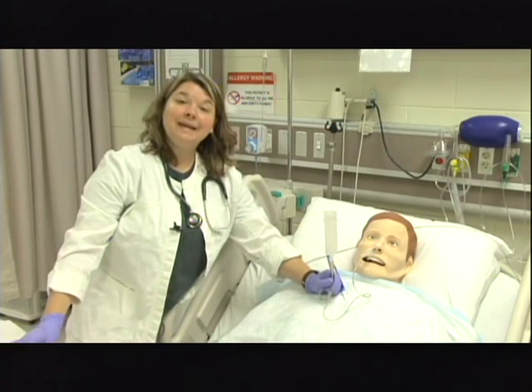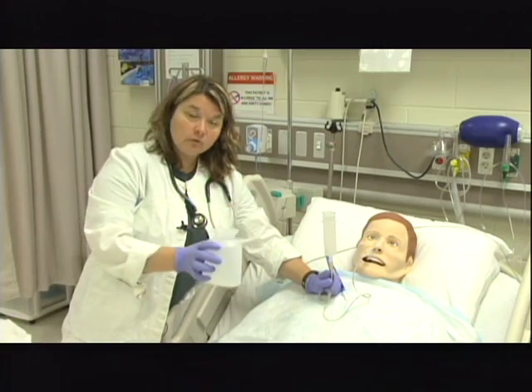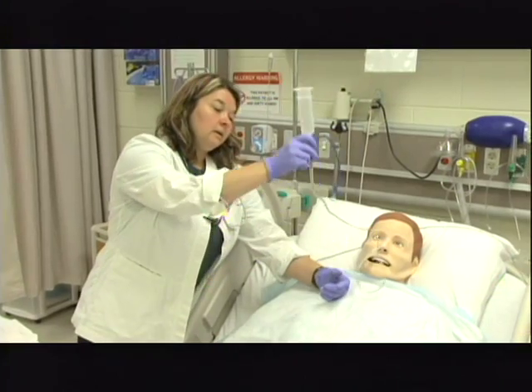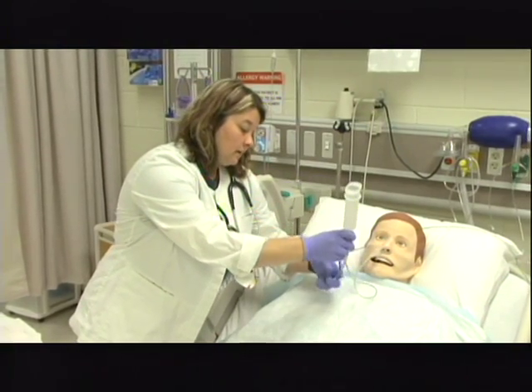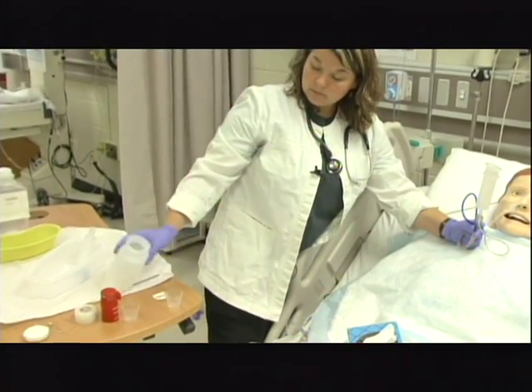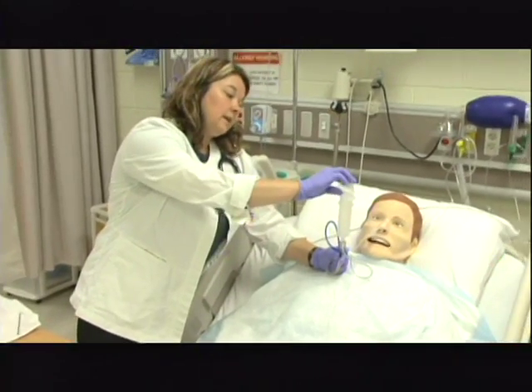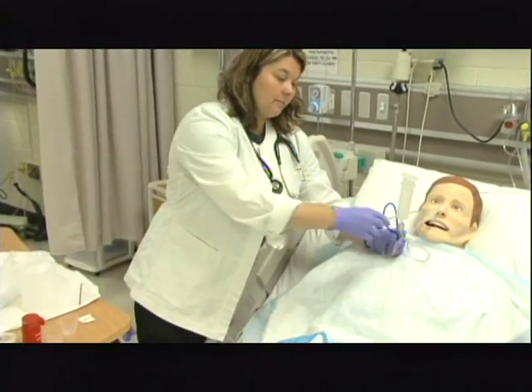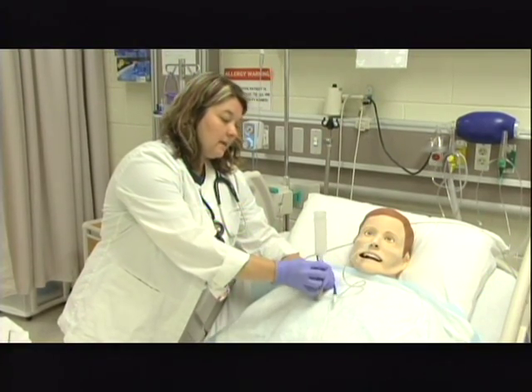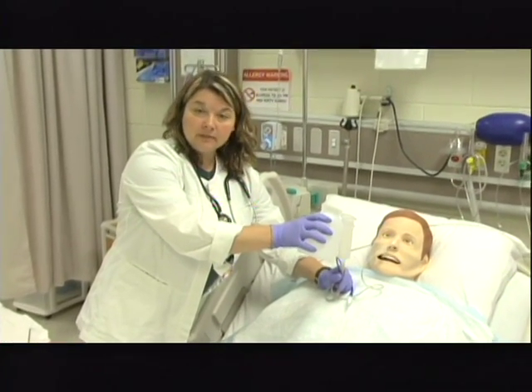Now let's say all the medication didn't come out of this cup. So I need to flush first with 10 milliliters. Let that infuse and come back and clamp again. Then I can put another 10 milliliters in here with the rest of that medication if I need to, re-agitate it and give again. All of it came out that time. I'm going to hold it up and unclamp, let it instill, reclamp it again. Then I'm going to come back and finally flush with whatever the prescribed amount of liquid is.